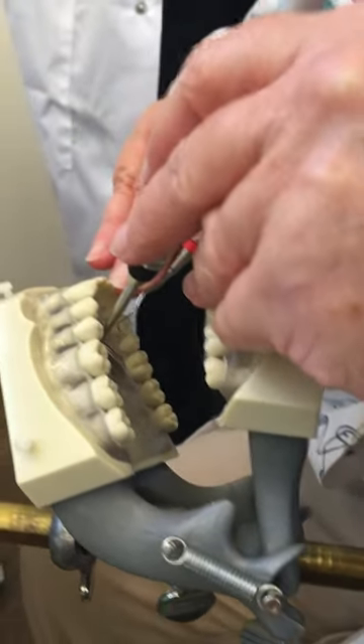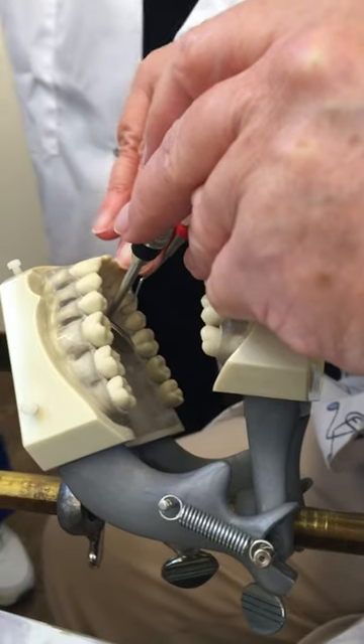The reason I'm not using gloves is so that you can see what my fingers look like.